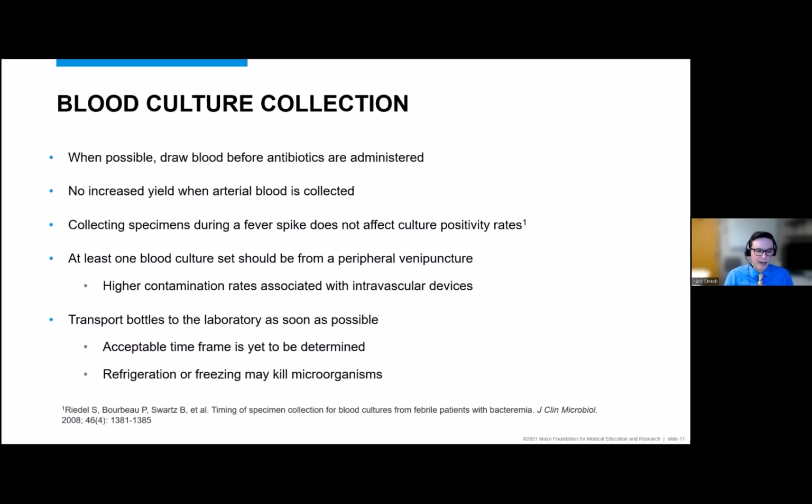We know that following antibiotic administration, a lot of the empiric therapy that's administered for these patients is very broadly acting, broad spectrum antibiotics that can have an effect on our ability to culture organisms if blood cultures are collected after an antibiotic administration. So we may end up falsely reporting negative blood culture results due to the fact that they were collected after the antibiotics. The antibiotics are working, but it doesn't give the clinical team any further information on what was really causing the source of the patient's symptoms. So best practice is that whenever possible, we want these blood cultures drawn prior to antibiotic administration.